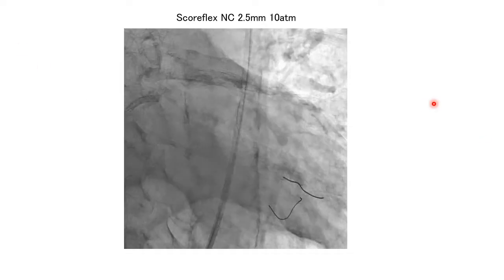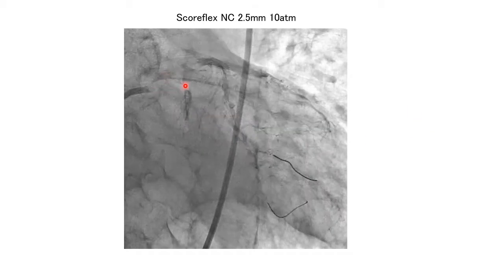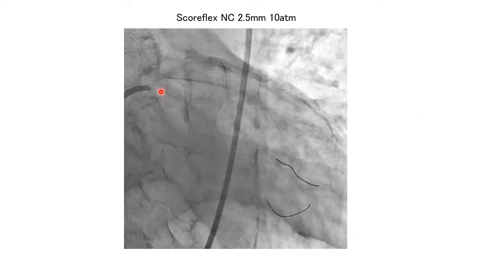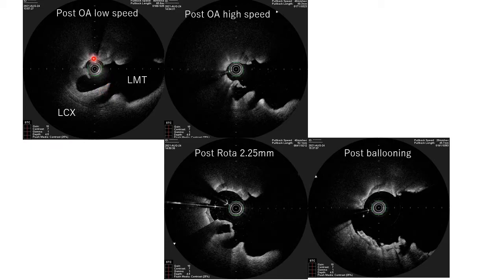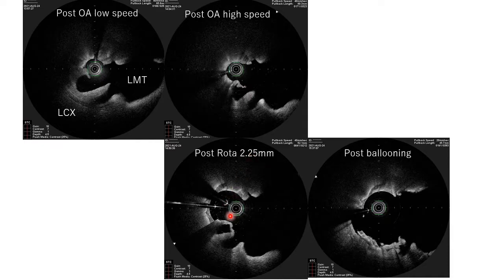After circumflex balloon inflation, expansion at the circumflex orifice was observed. OCT demonstrated the ablation effect after orbital atherectomy at low speed, and further ablation effect at high speed. Rotablation with the 2.25 mm burr showed additional ablation effect. Balloon dilation created a crack, achieving wide opening of the circumflex orifice.